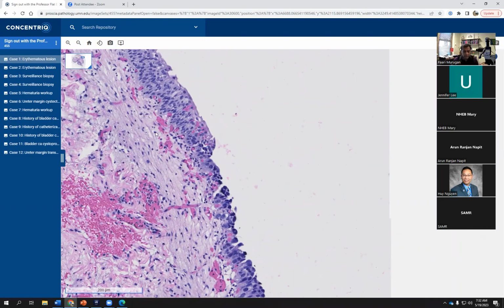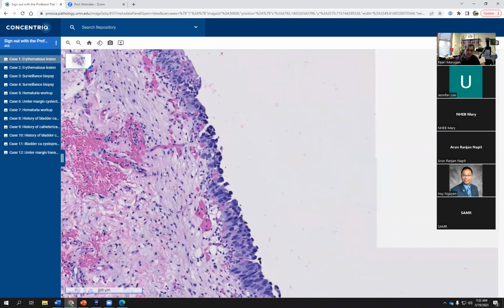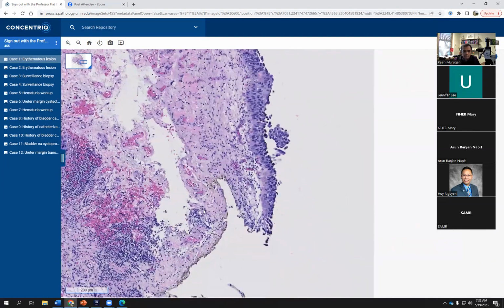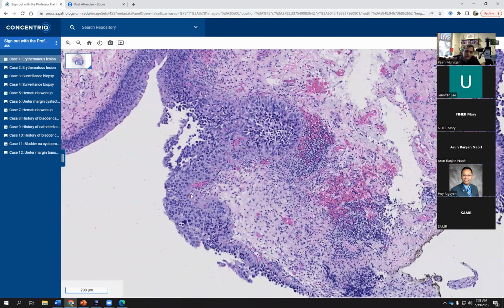It's always useful when you have a comparison of the normal urothelium, as I said, but in some cases, you may not have the normal urothelium, so you will have to depend upon the other morphologic features that I just described. Right, so we keep scrolling along, and everywhere it's a flat lesion, so it's easy to call this carcinoma in situ. But oftentimes, as you well know, we come across cases in which it's not completely flat. It is slightly thickened, and you might see, for example, an area over here, it is slightly thickened, and one could potentially visualize some early papillary formations in this area, right?